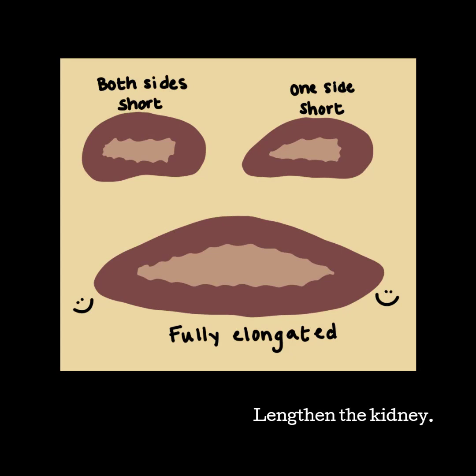This technique won't work on everyone, but you should always try to get the longest measurement of the kidney. That means finding the window that allows for more what I call pointy poles. Once you get one pole to be sharp, don't move that side of the transducer. Pivot the opposite side to elongate and sharpen the other pole.